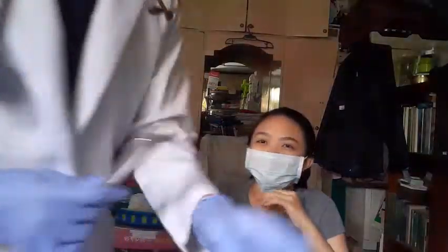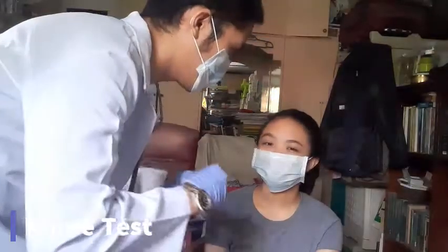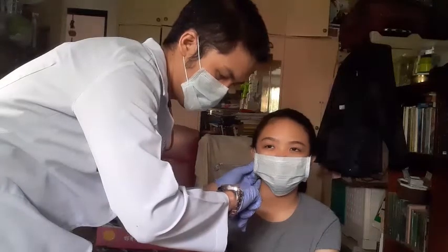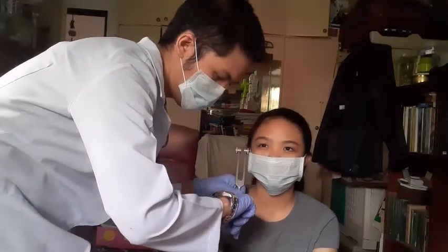Firmly place a struck tuning fork against the mastoid process and instruct the patient to tell when the buzzing sound stops, noting its duration. Immediately move the still vibrating tuning fork near the external auditory meatus and instruct to tell when the buzzing sound stops and note the time. Compare air and bone conduction and do the same on the other side.